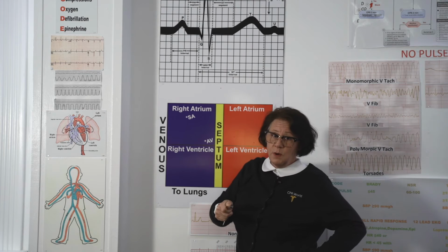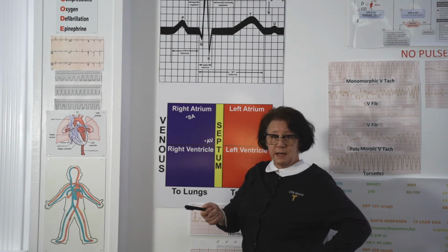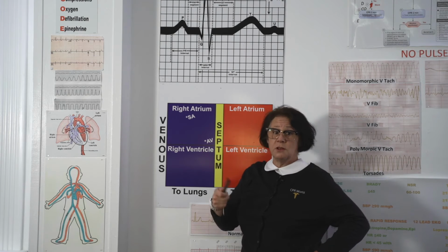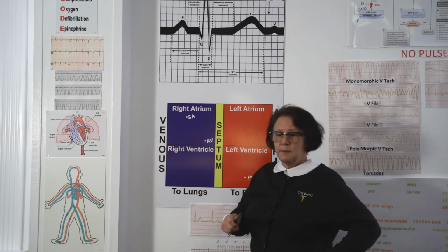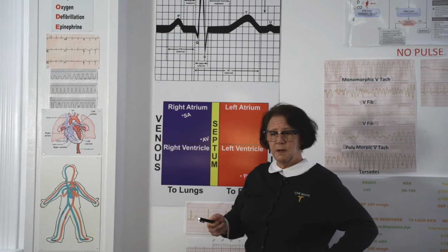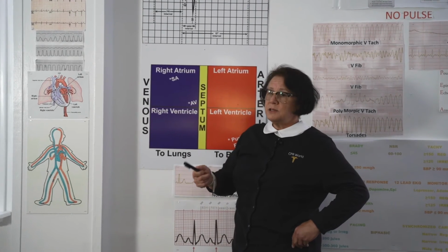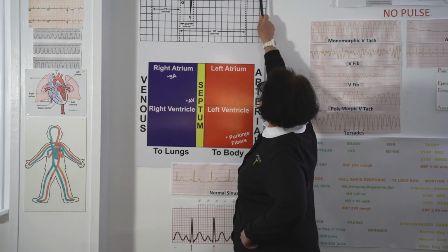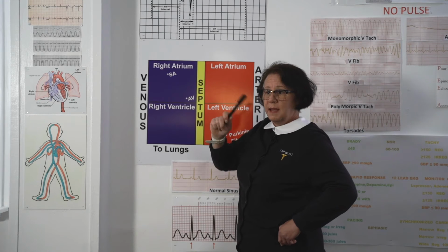You'll only see U waves when your patients are very bradycardic, heart rate's less than 50. Not every bradycardic patient will have a U wave. The slower their heart rate goes, the larger the U wave will become. So U waves are really created by electrolytes we commonly replace, like potassium, magnesium, calcium. Someone with a slow thyroid would have a U wave. Certain medications will give you a U wave. Not all of your patients will have a U wave, and having one doesn't make them healthier or sicker.